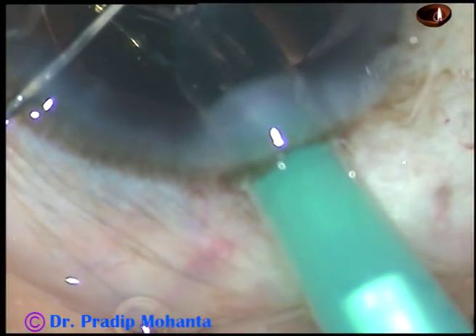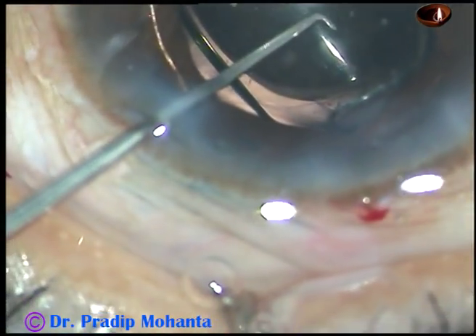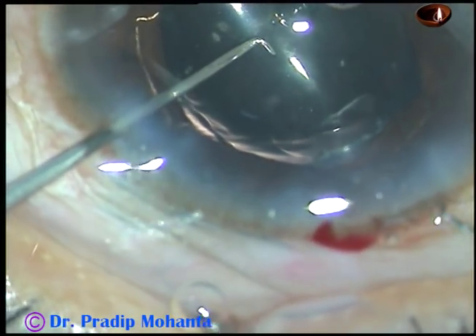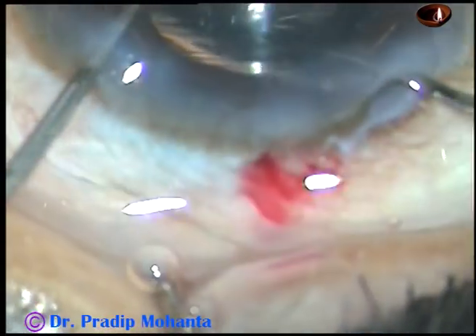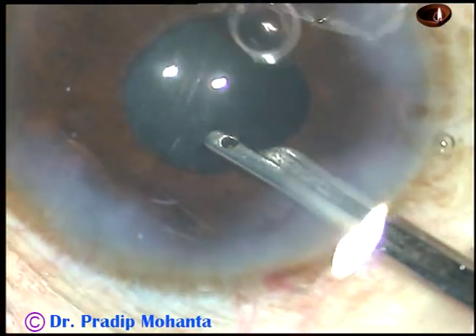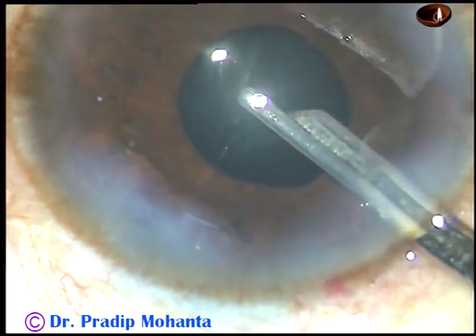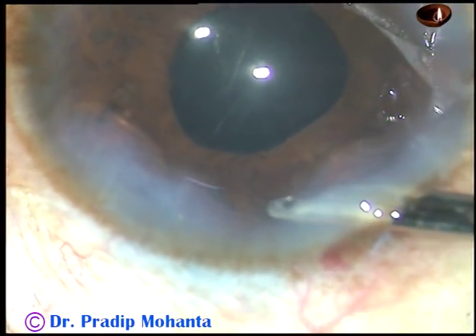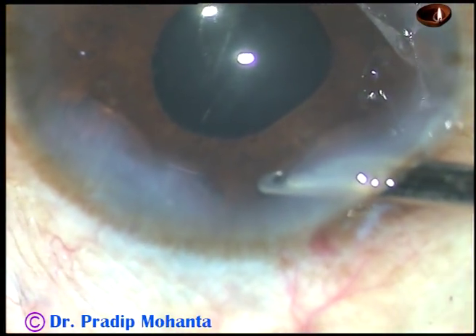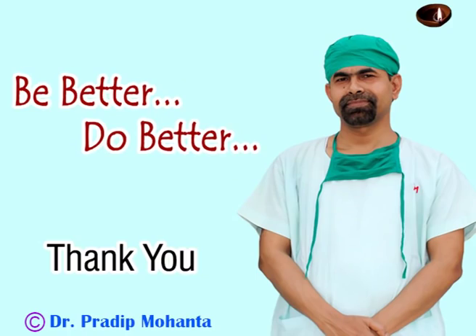After cortical cleanup, viscoelastic was injected and a foldable intraocular lens was implanted in the capsular bag. After dialing the lens in the capsular bag, the B-hex ring was removed. After hydrating the side ports, this is the final lavage of the anterior chamber. You can see that the pupil is round, the lens is nicely placed in the capsular bag, the anterior chamber is nicely formed, and the case is concluded. Thank you very much for watching. Hope this video will help you in developing your surgical skills. Be better and do better.